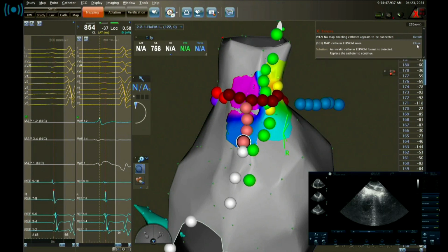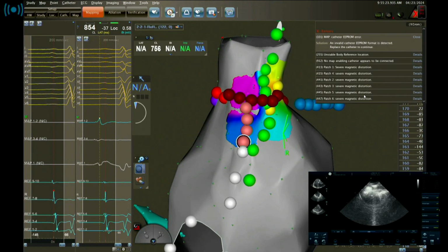So we have, let's say, 30 minutes for demonstration. For the rest, now we have a problem with the connection of the mapping ablation catheter, because it could be because of using the Centauri system. So I'm waiting until I see the icon of the Navistar catheter, a Smart Touch. There is kind of an unknown error. It's too much energy in the Carto system.